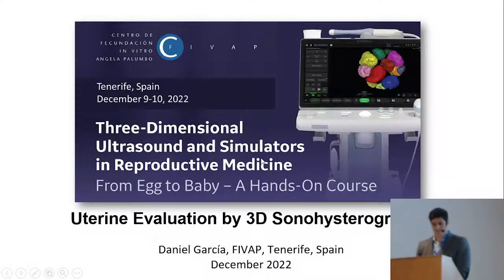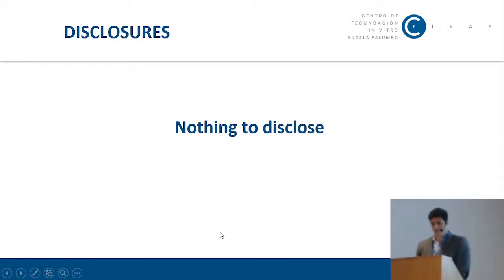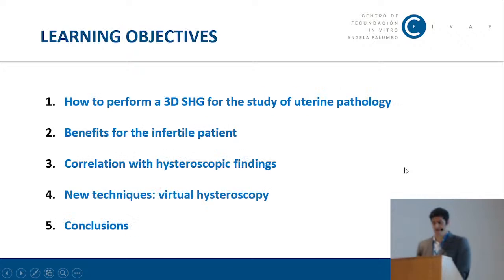The talk is divided into 4 parts, focusing on the most important elements: how to perform a 3D sonohysterography for the study of uterine pathology, what the benefits are for infertile patients. We will also show the correlation between hysterosonography and hysteroscopy. I will talk briefly about virtual hysteroscopy, and finish this speech. I will conclude with a summary.